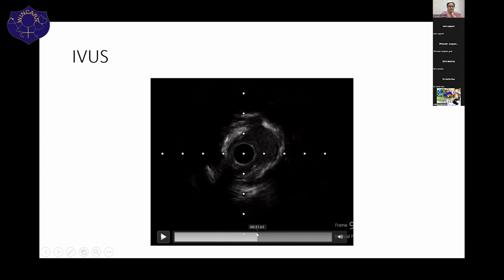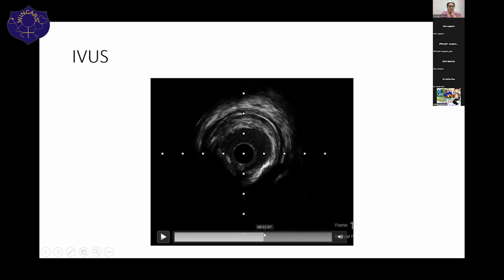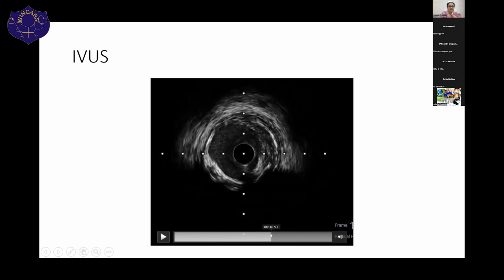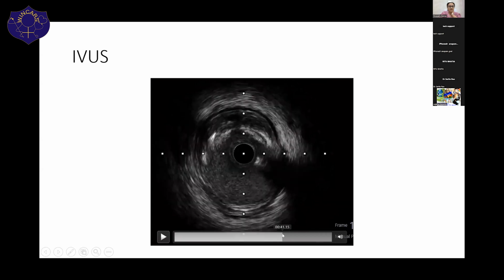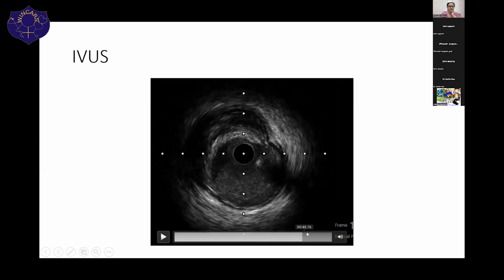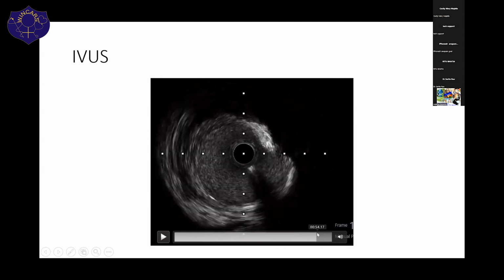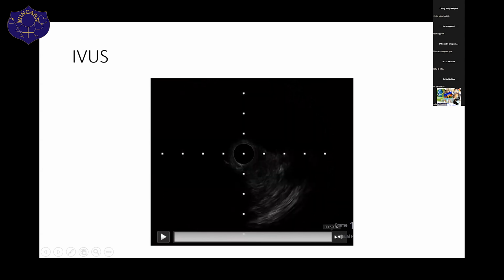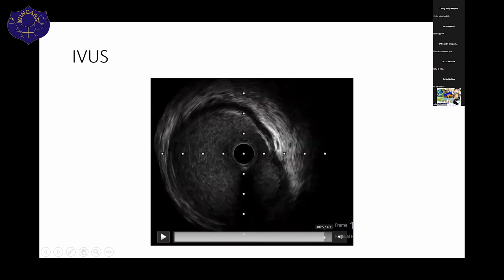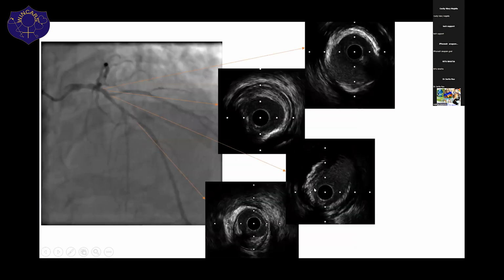And as you come proximally, you can see the left main is diseased. So basically, there is no landing zone. And then we decided that there was not much calcification. As you come proximally, you can see that the left main is diseased, and this is the shaft involvement. And as you come ostially, it's a very huge left main, as you can see. So at this point of time, this is the analysis. You can see the still frames.